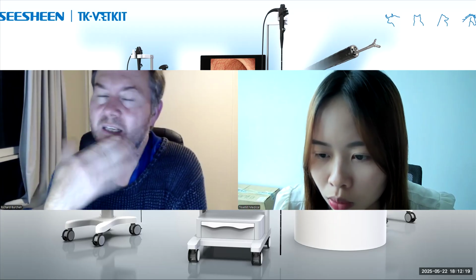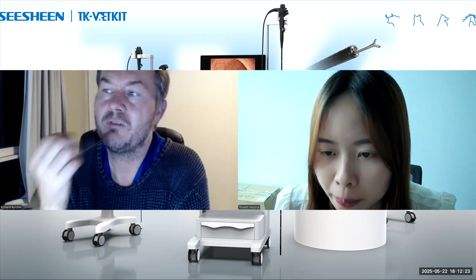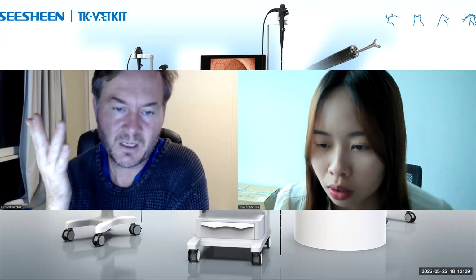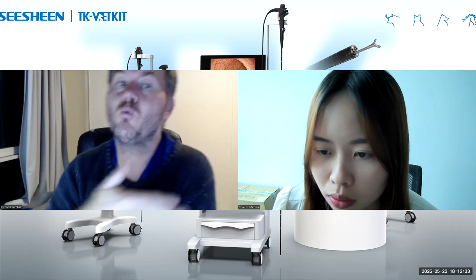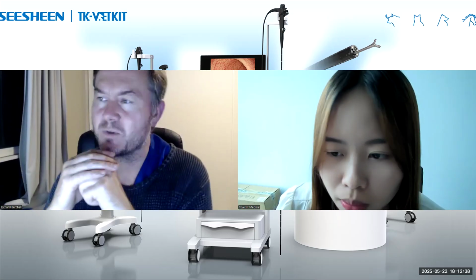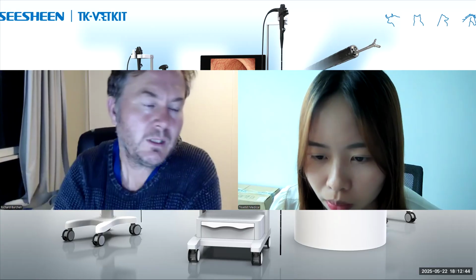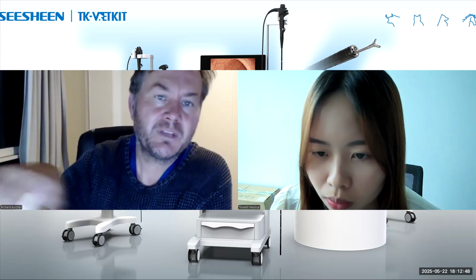I actually think, and it depends on what you've got already, but if you were going to buy a scope, you'd be better off learning to do rhinoscopy with a small flexible bronchoscope, which I have done in the past, because that would have wider applications than a rigid scope. So the short answer is yes, you can, but you're going to have a relatively limited ability to see the whole airway, because you can't really maneuver that scope.